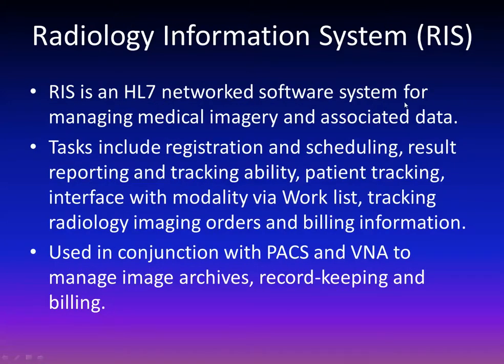So a radiology information system is going to be referred to as a RIS, and a RIS is an HL7 networked software for managing medical imaging and associated data. That HL7 part means that if it communicates with any other parts of the process, it has to be through an HL7 interface.